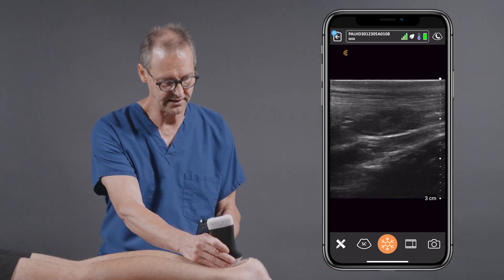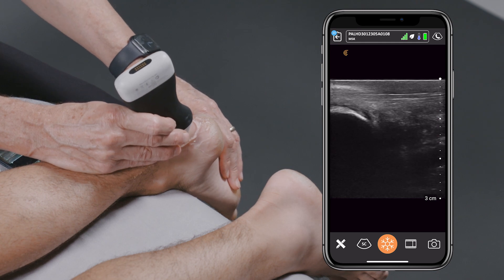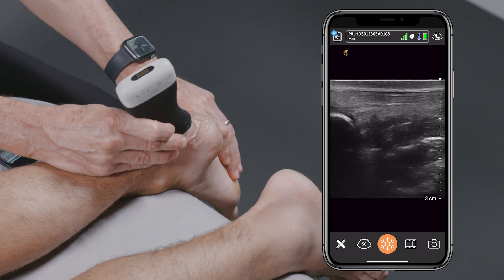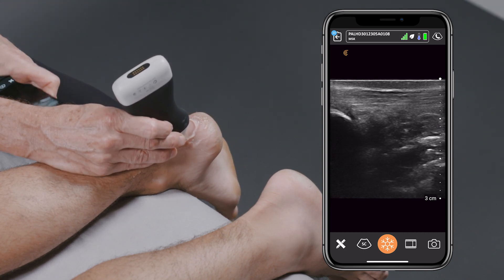It's really a very easy exam to do. If you do see some type of injury, you can augment your exam by either dorsiflexing or plantar flexing the foot to see if there's evidence that the tendon in fact pulls apart and there is an injury to this structure.